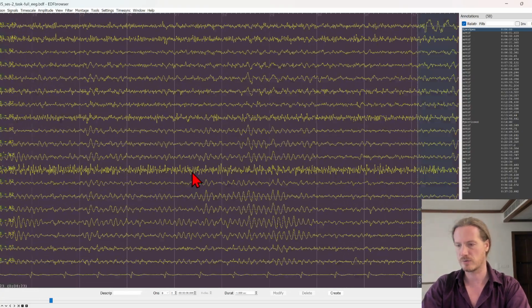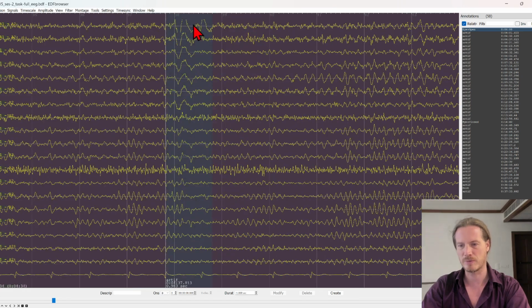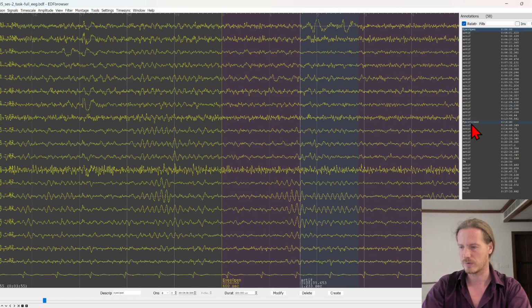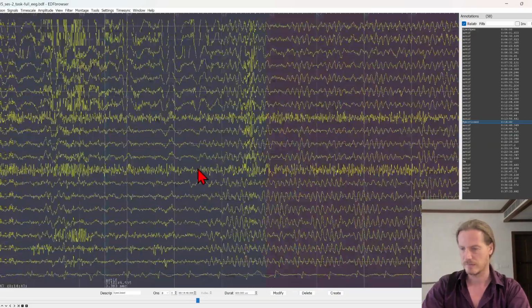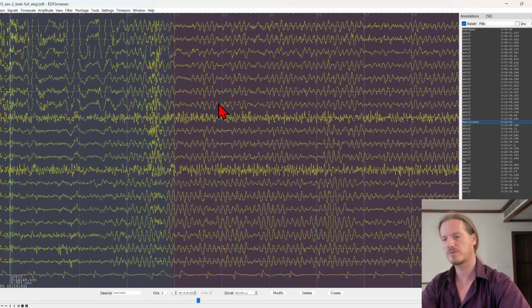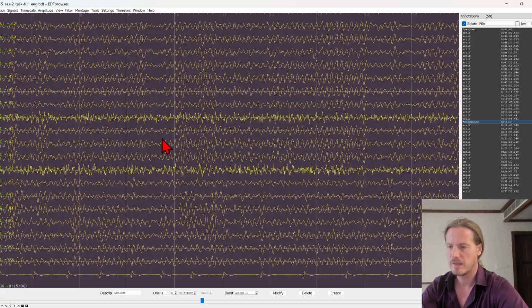And as we scroll forward in time, here's another little eye blink that he has there, so that part gets removed and this part gets removed. But in between we have all this good data. And we have their eyes open period, and then we have their eyes closed period. You can see here the list here. He's got quite a bit of noise, so actually all of this part gets removed. But here we have all this clean alpha waves. 2 positions are noisy, but those we don't consider in the circle anyway.